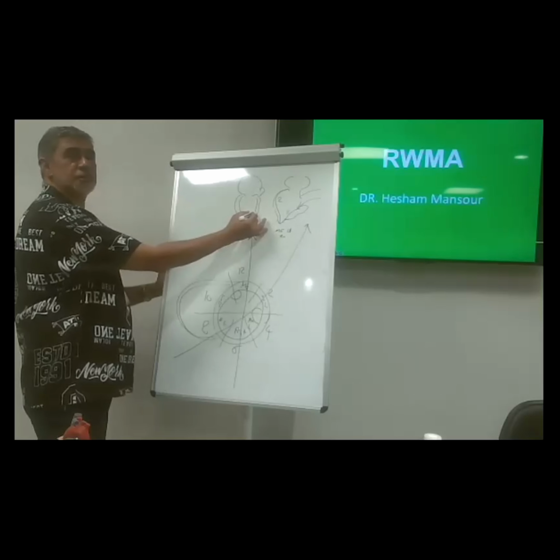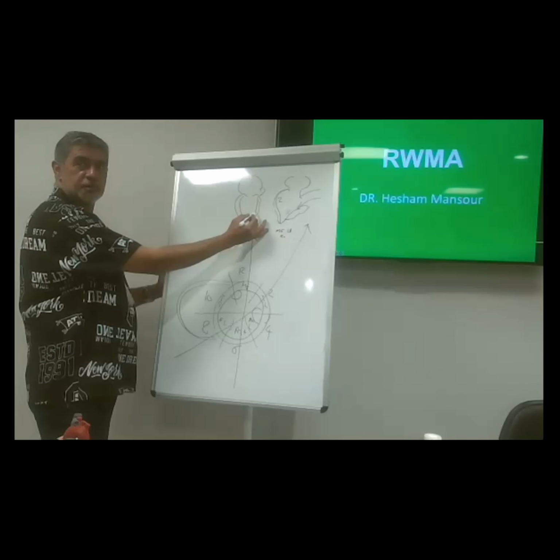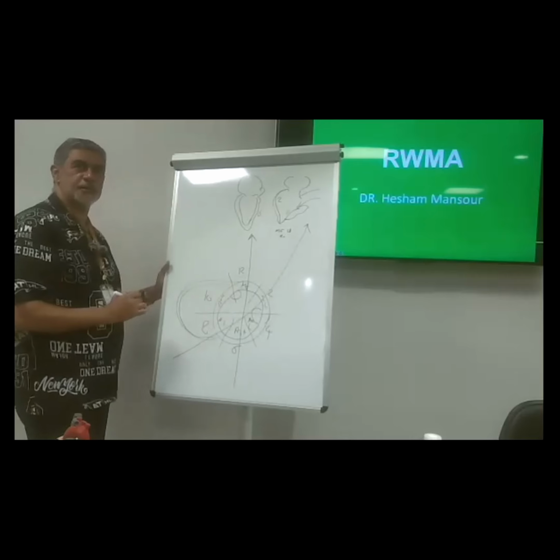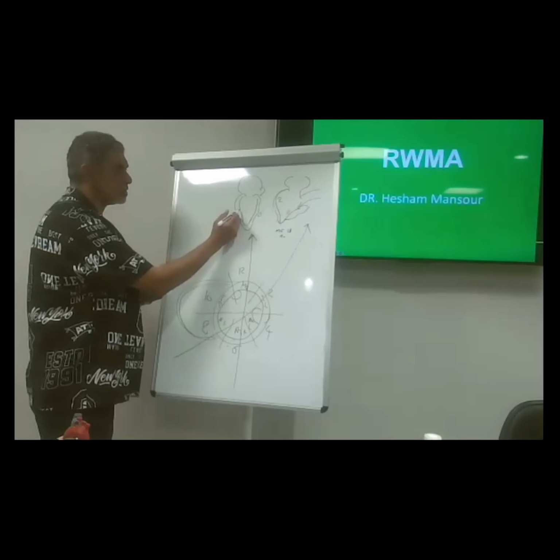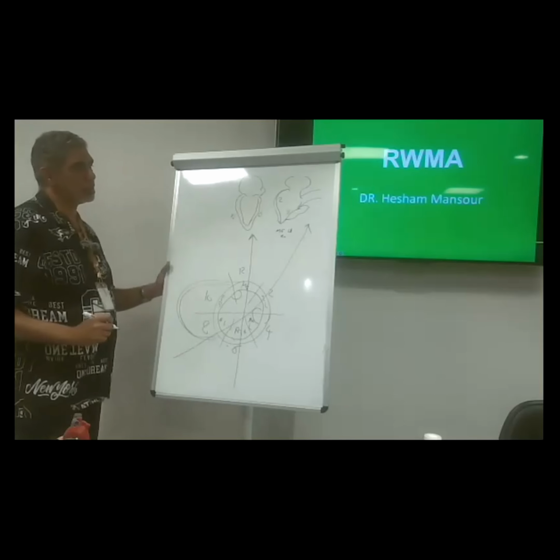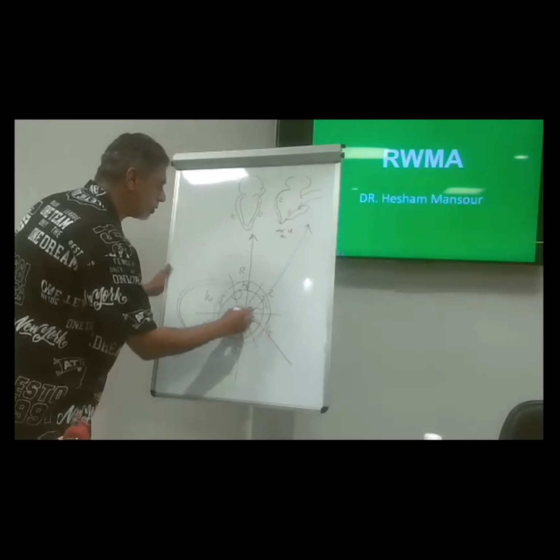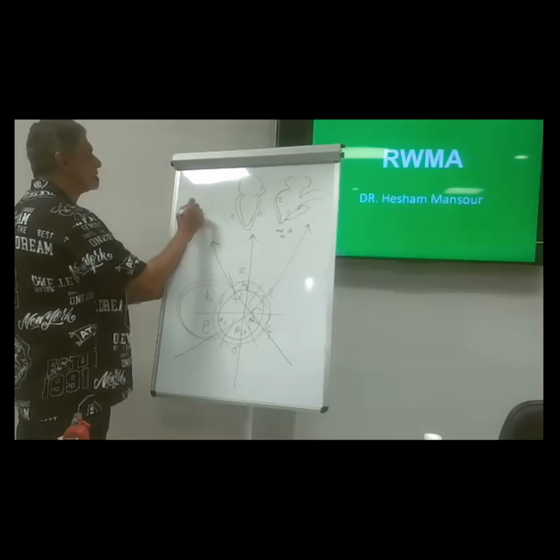So what's this wall? Not inferior? Anterior or inferior? Anterior. So this is number 6. 6 o'clock. What's this? Inferior. Definitely it is inferior. Okay. Again, another beam will go like this and will give us this.